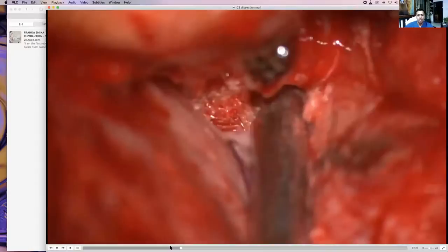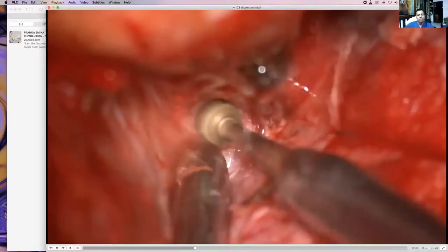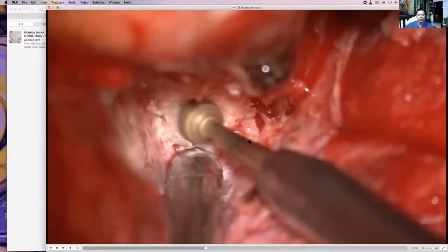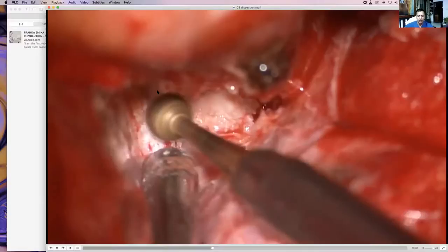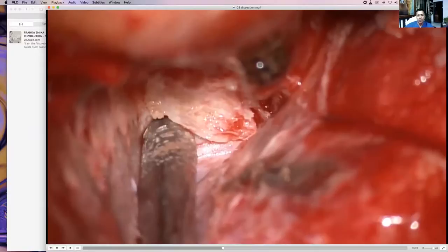Being dissected, you can see lateral to that is the superior orbital fissure. Now we are drilling the clinoid away. Be very, very careful drilling this clinoid. This will be optic nerve. You're drilling the clinoid above the carotid oculomotor membrane, which is covering the C3 carotid. So again, this is frontal lobe, temporal lobe, cavernous sinus. And this part, what I'm showing right now with the arrow, that is your optic nerve. So I'm drilling off the clinoid there under very high zoom, slowly seeing whether it is breaking. It's easily breaking. You see that?